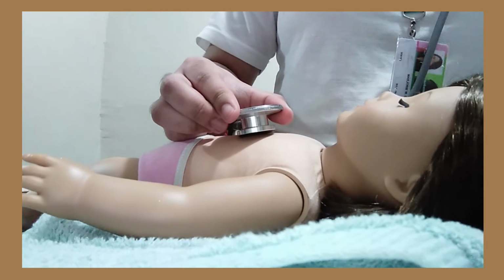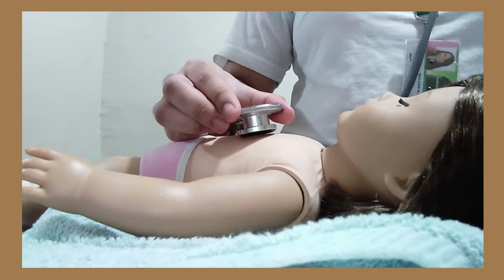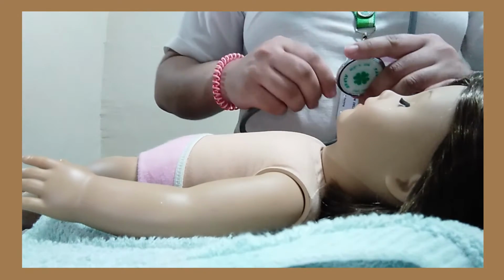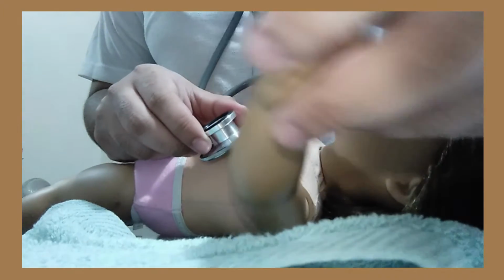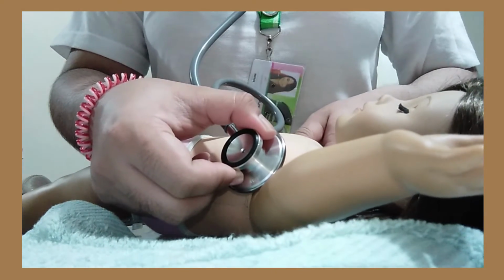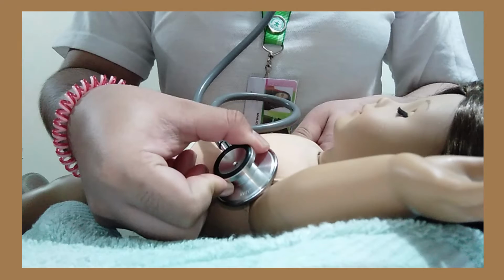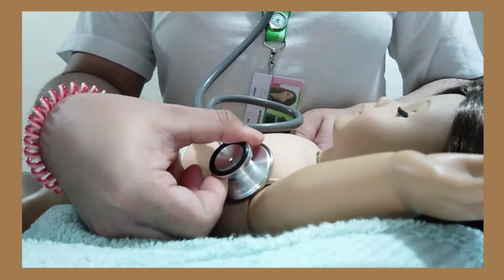Okay, so for mitral regurgitation, without moving the patient, I would be listening with the diaphragm in the axilla with the patient in full expiration. Okay, ma'am. Again, I would be instructing you to take a deep breath in, then breathe out all the way and just hold it for a while. Okay, deep breath in, deep breath out, hold it.